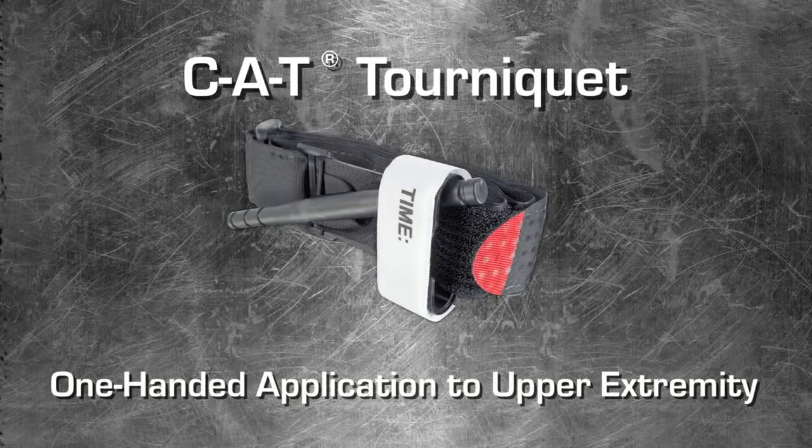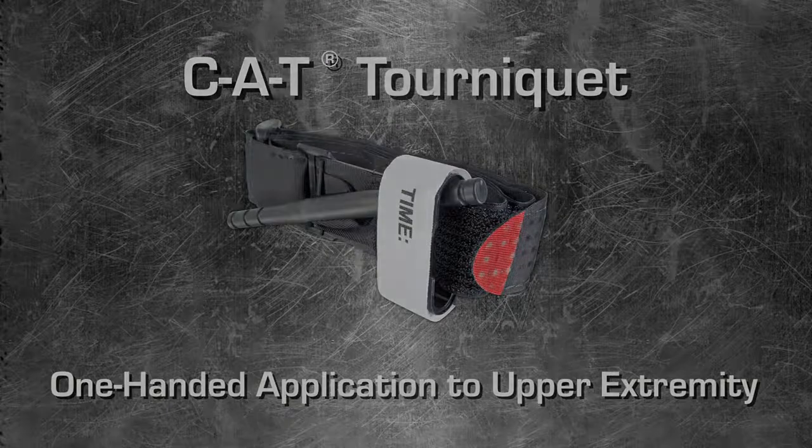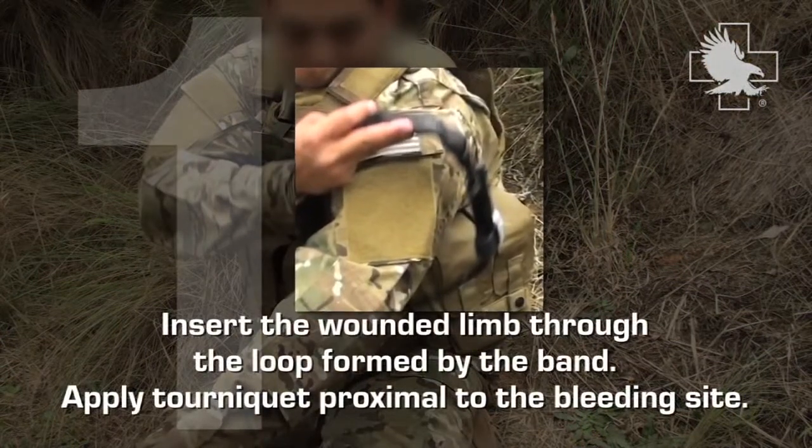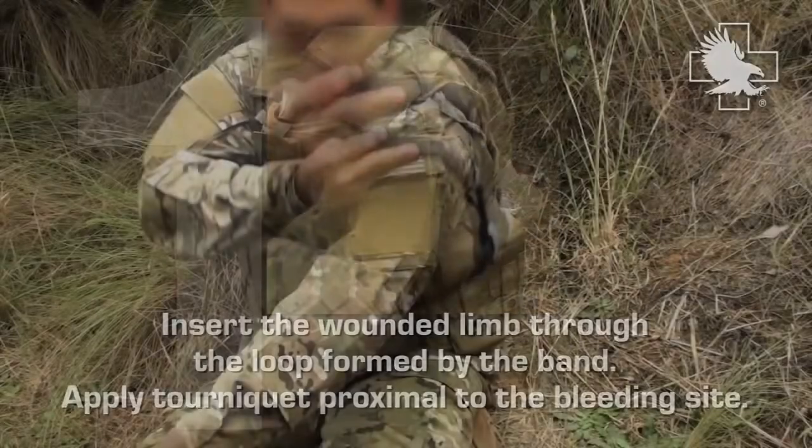Welcome to the CAT Tourniquet video tutorial: one-handed application to upper extremity. Insert the wounded limb through the loop formed by the band. Apply tourniquet proximal to the bleeding site.